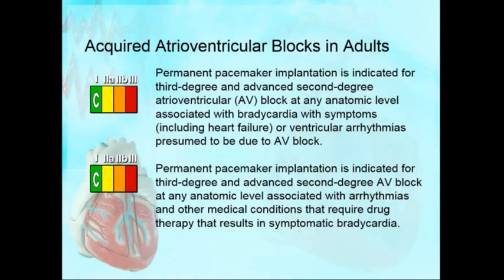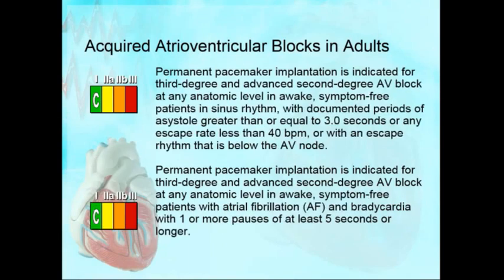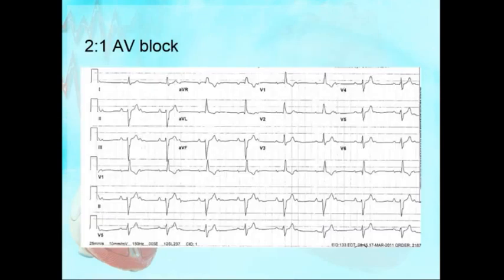Okay. Pacemaker, this is more for cardiology here. AV block, 2:1 block. 2:1 block also has been tested on exams before. What is 2:1 block? One P gets conducted, the other P does not get conducted.